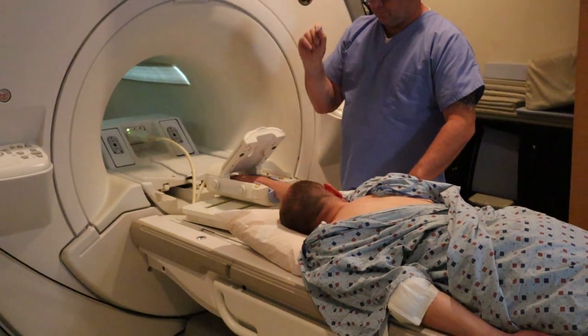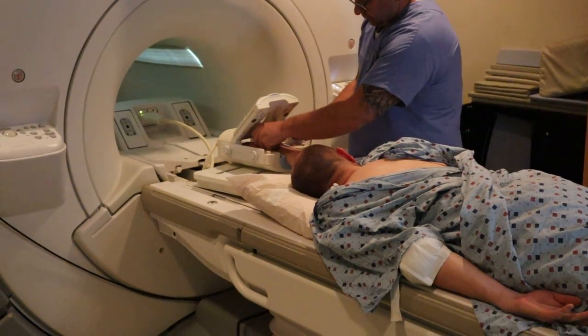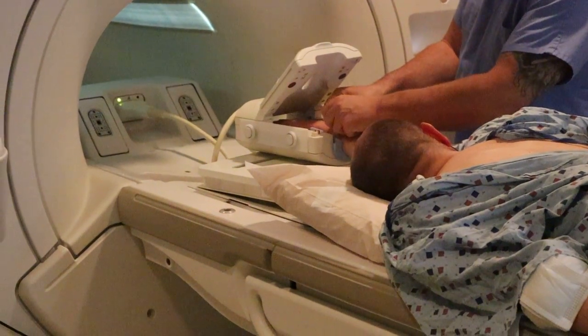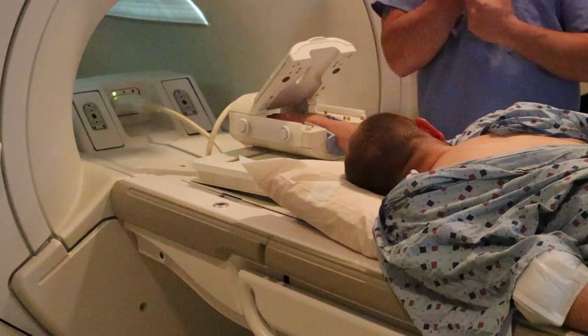What the technologist has in his hand is a vitamin E tablet. What you want to do is mark above and below any sort of mass that is palpable.